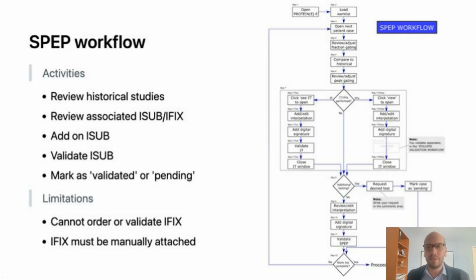Now, there's a little difference here for immunosubtraction. They're able to validate right within this workflow. But due to limitations of the software, immunofixation cannot be validated within the SPEP workflow and has to be validated in a subsequent workflow schema. After reviewing these associated studies, the pathologist can either request additional testing, which we accomplish through a note to the technologist within the interpretive comments, or they can go ahead, add their digital signature, and validate the study.